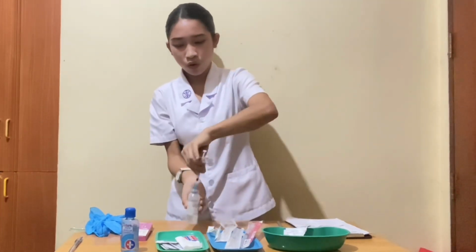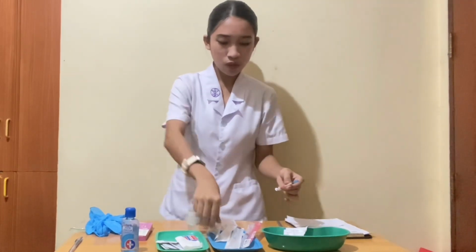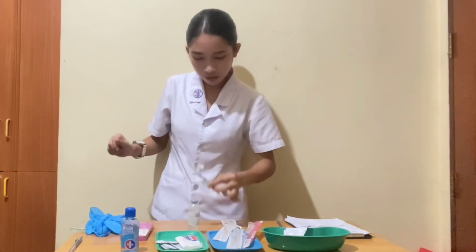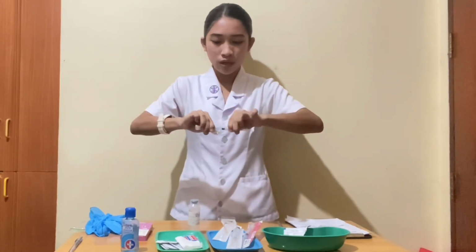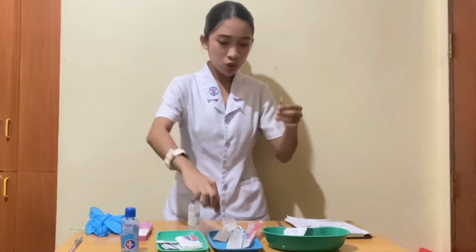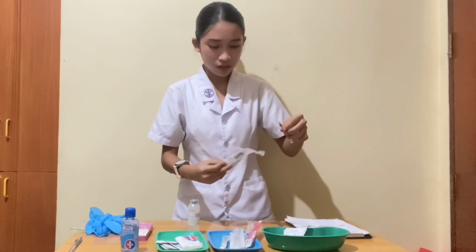Then I'm going to recap this to avoid pricking our fingers, and lock it like this. Then I'm going to get the filter needle or the aspirating needle and replace it with the regular needle.